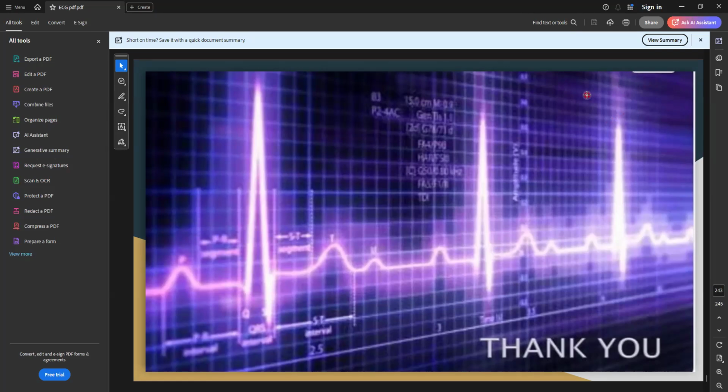Okay, so one is myocardial infarction, the other one is hyperkalemia. Especially in ICU patients, when you are monitoring continuously, if you see T-wave changes, you have to ask for immediate serum electrolyte levels, in hyperkalemia and hypokalemia. You asked me about the main conditions where you have to look for ECG changes. Yes, one is myocardial infarction, then electrolyte imbalance, especially hyperkalemia and hypokalemia. And where else can you see them?